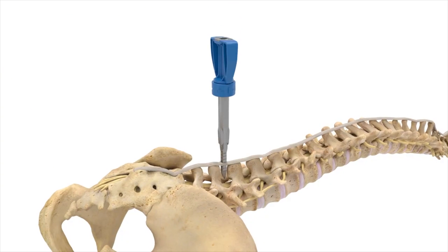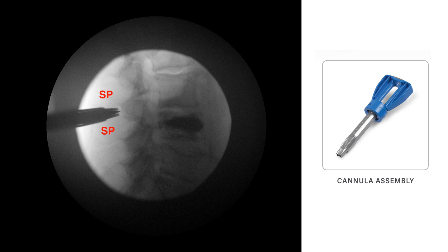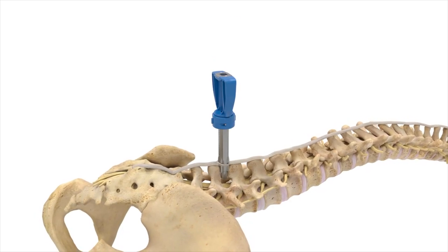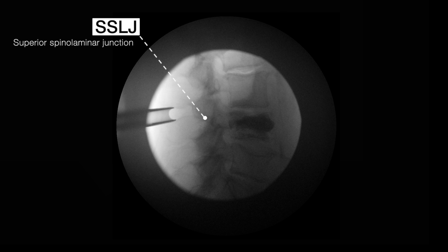The cannula assembly is then inserted over the dilator and advanced until the distal tip reaches the dorsal aspect of the facet shadow and is seated between adjacent spinous processes. Both the dilator and the cannula assembly handle are removed, leaving only the outer cannula, also known as the working channel. The ideal position of the working channel is about 10 mm dorsal to the spinal laminar junction.